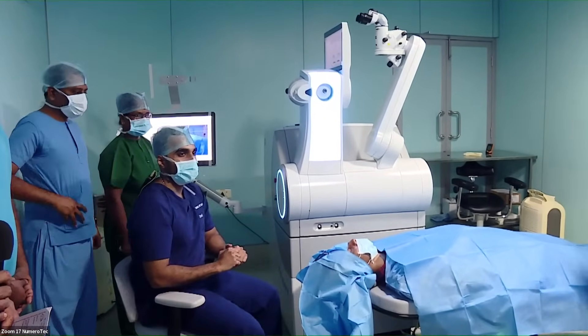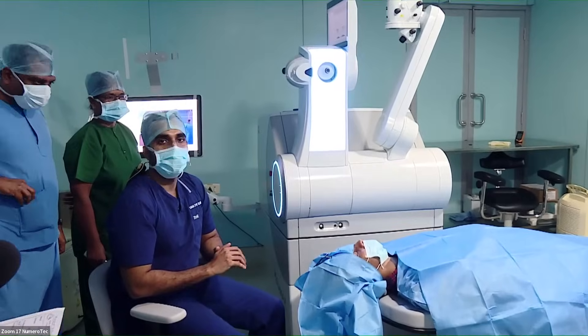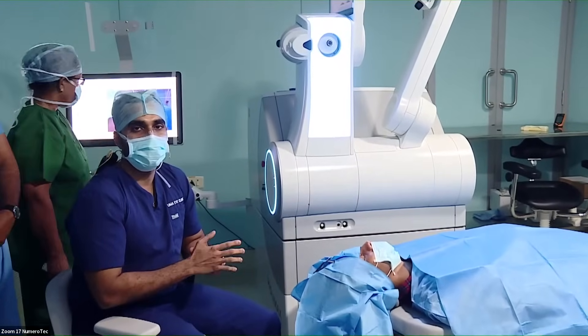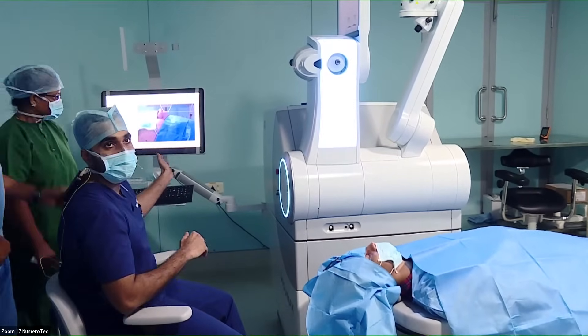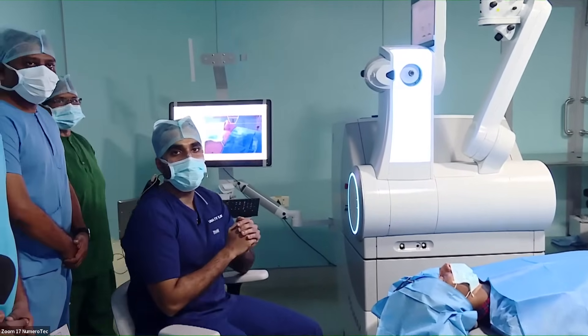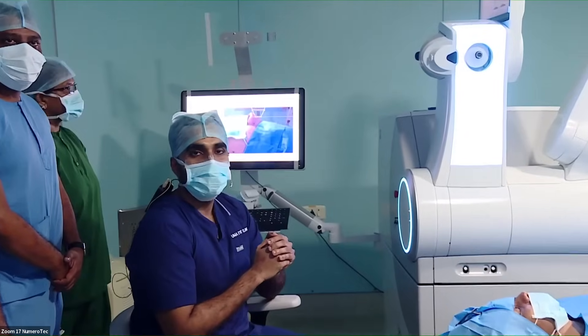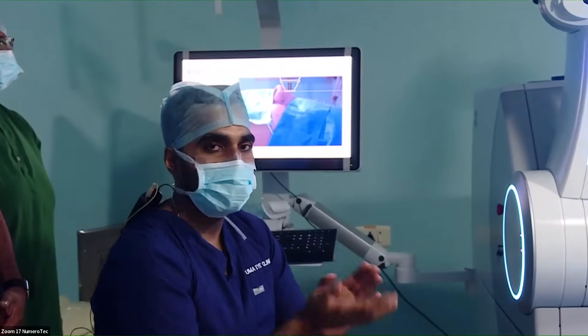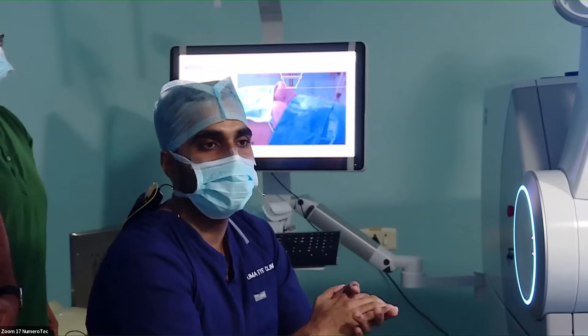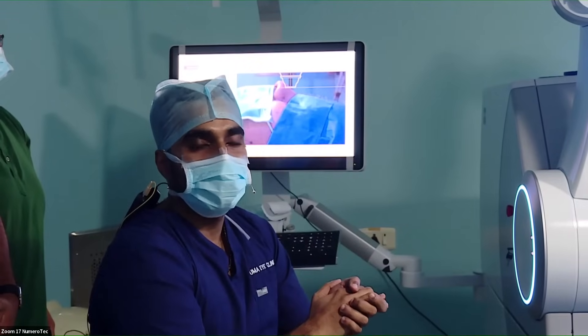I'll give you a quick introduction to the new Visumax 800 laser. This is the machine known as the SMILE Pro. Here we have a planning station where you enter all your patient data: name, age, sex, refractive error, corneal parameters, etc.